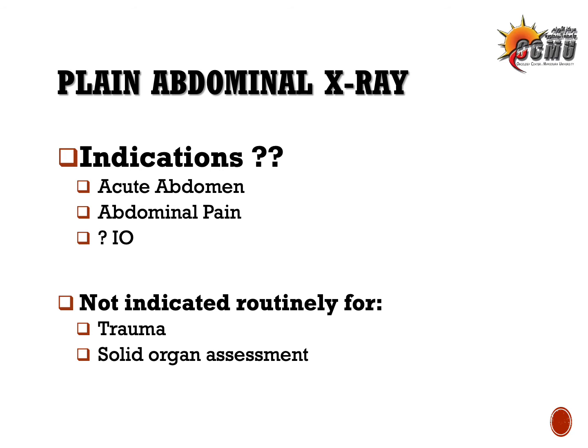And of course, abdominal X-ray is not the first line of investigation in a patient presenting with trauma to the abdomen, penetrating trauma, and not for solid organ assessment. In those conditions, we order other imaging modalities like FAST scan or even CAT scan or CT.